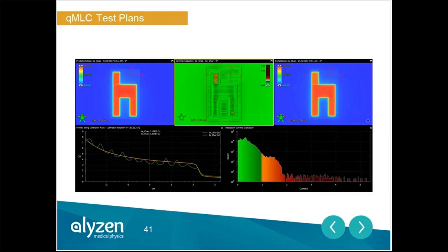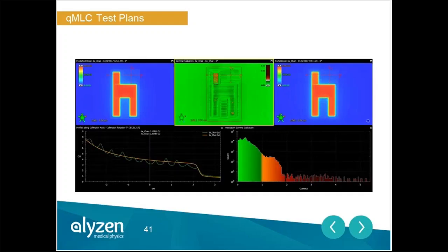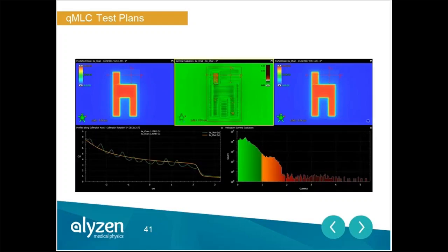As an example of how quickly it can change, I think I changed the transmission between this image and the next image by a couple tenths of a percent. I think I went from 1.25 to 1. And you notice that the transmission has dropped dramatically. It's not anymore following through the middle. I think I'm underestimating the transmission here, and the previous value would have provided me with a better solution.